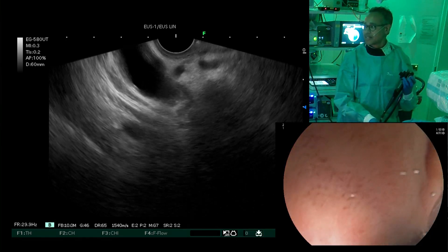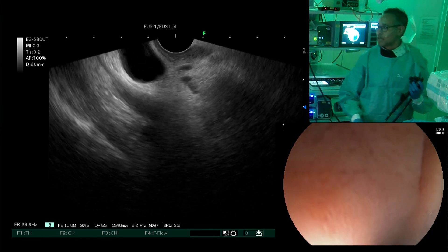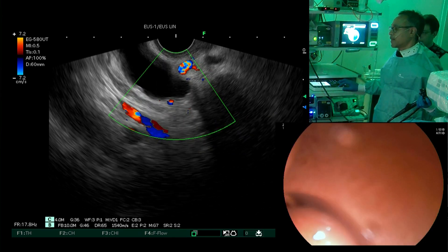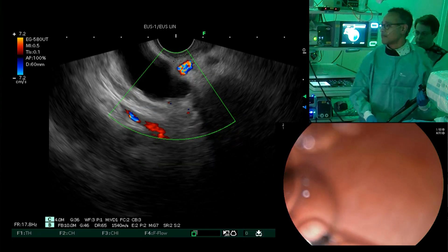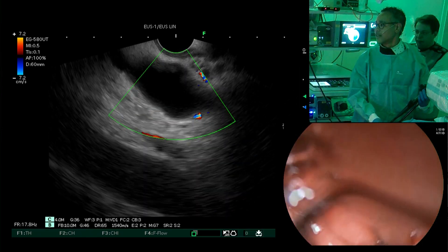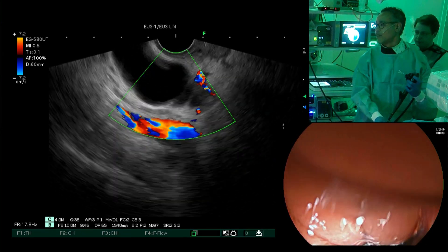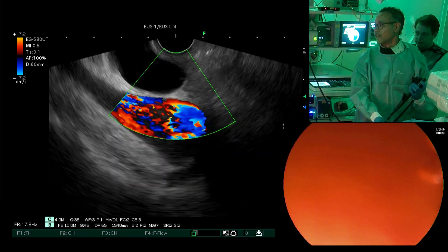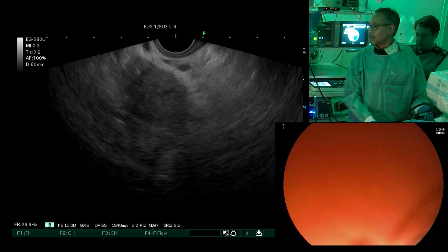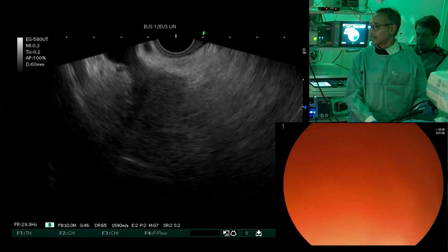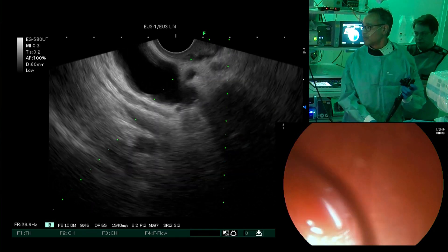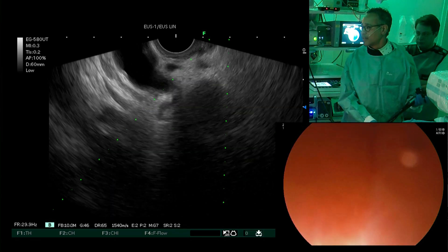We're going to have a look at the common bile duct, which you can readily see here in the EUS image. When I start the color Doppler, you see that this is the common bile duct, and supposedly the hepatic artery here at one o'clock and down below the portal vein. And here the bile duct occludes — and here you see a tumor.